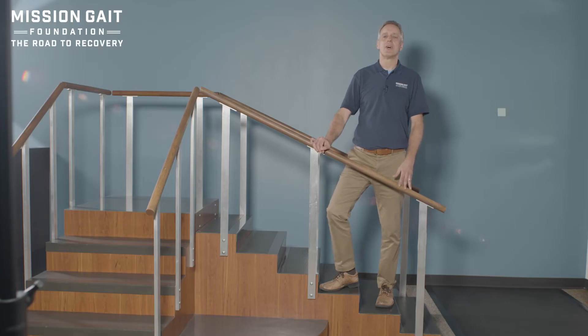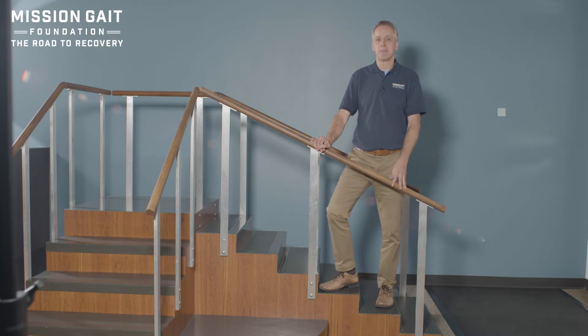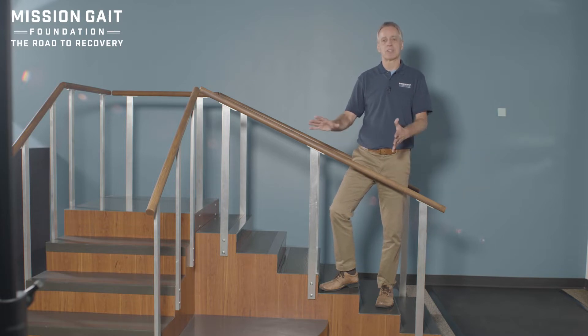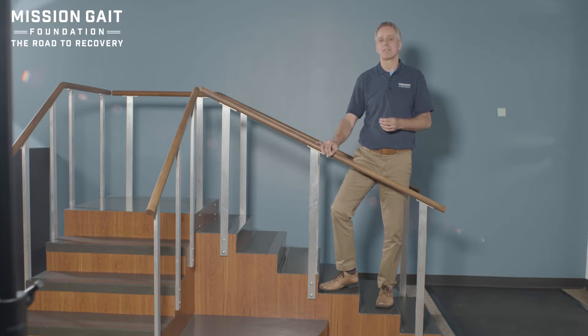Hi, this is David Lawrence, CEO and founder of the Mission Gate Foundation. In this video, we're going to be talking about training to ensure safe function both over and around community barriers. The primary concern for most folks is dealing with stairs, ramps, doorways, curbs, and uneven terrain. We're going to start with stairs. I want to show you a couple of things that I talk with patients about every day in the practice, and then we're going to demonstrate that and have patients demonstrate that for us.